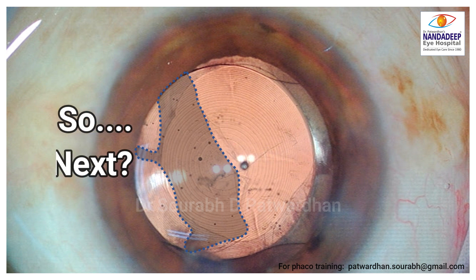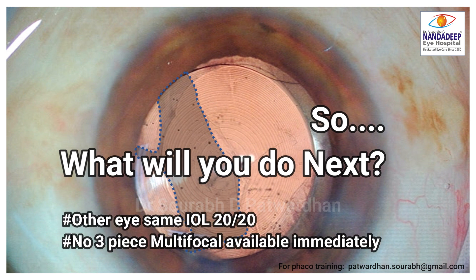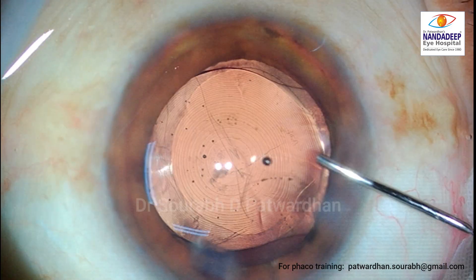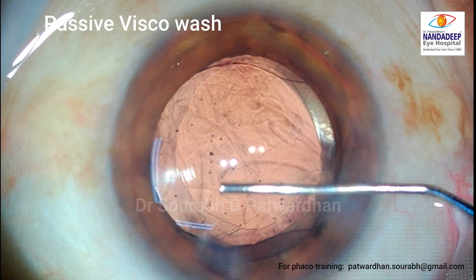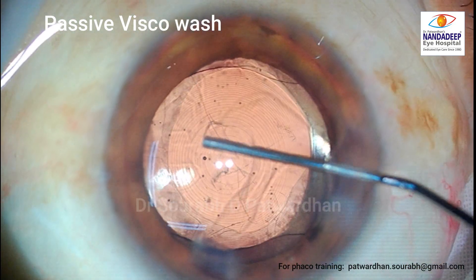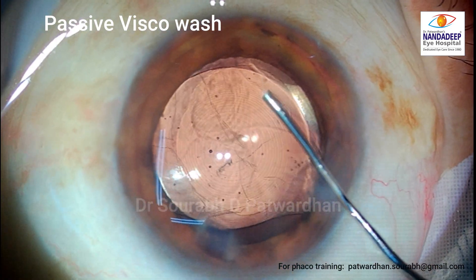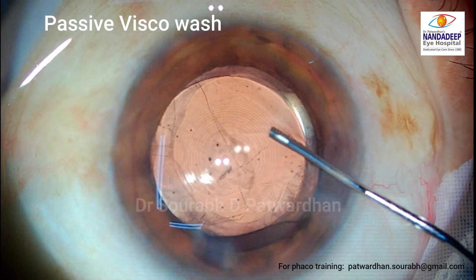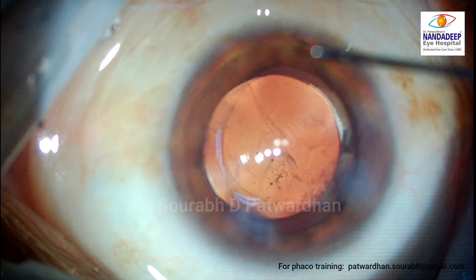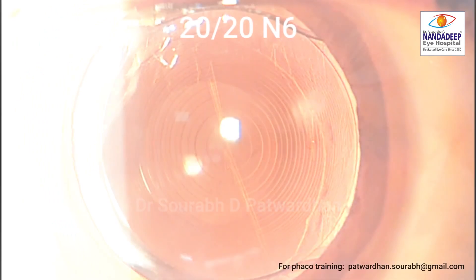So what will you do next now? I don't have a spare 3-piece multifocal IOL, and the other eye already has the same IOL implanted with great vision. This is what I did: I decided to wash out the viscoelastic and not to touch the IOL at all, because if I try to rotate this IOL or do anything in the anterior chamber, it's likely that the anterior vitreous may rupture and the PC rupture may extend. So I just decided to wash out the viscoelastic passively without raising the anterior chamber pressure and close the surgery.